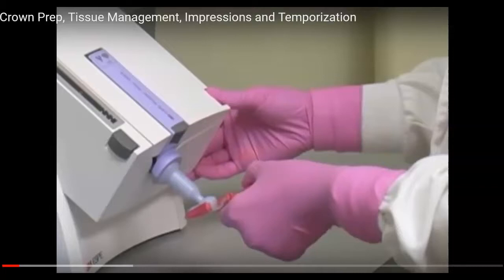In the cartridge there's a plunger, and when it's loaded into the extruder gun and you press the trigger, it pushes that plunger deeper into the cartridge, which then forces the material out into the tip. Because the tip on the inside has a swirl pattern to it, it mixes the material as it's coming out of the extruder gun or the cartridge.